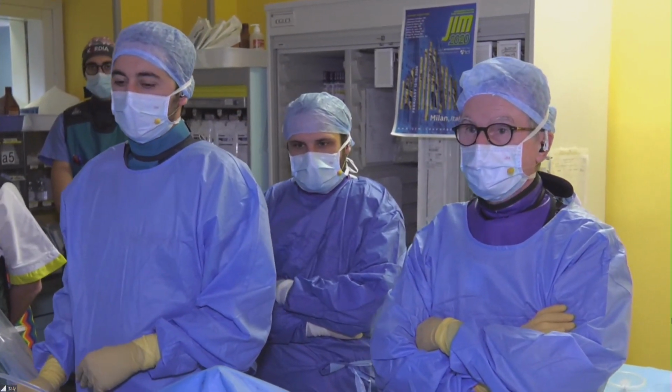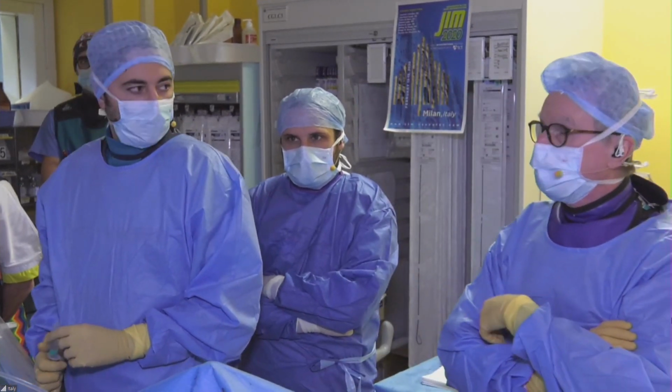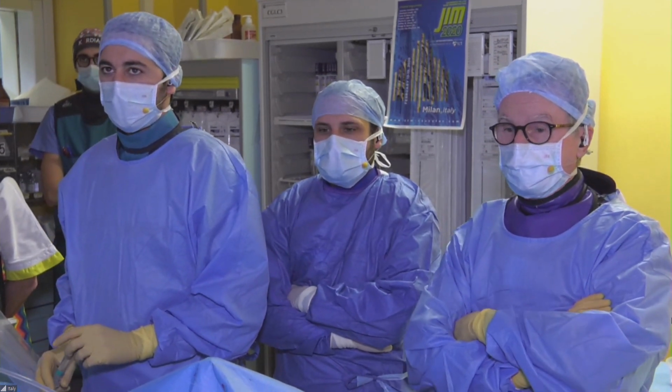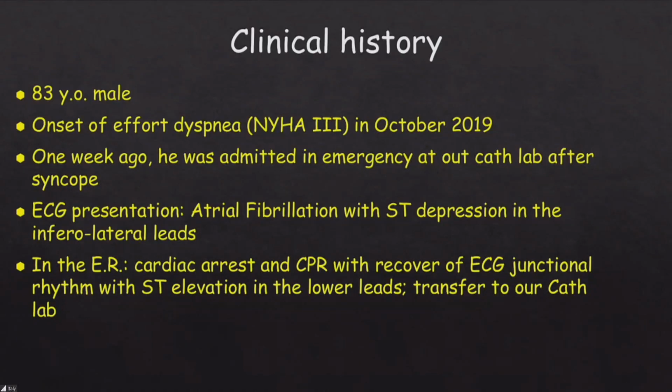So the first patient, and then we have another patient in the other room. Alessandro will present the history. I already have cannulated the vessels, but have done nothing except FFR and IVUS. Good morning to everyone. It's a great pleasure to be here and show this interesting case.